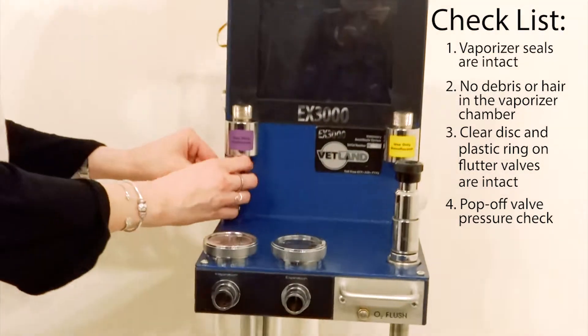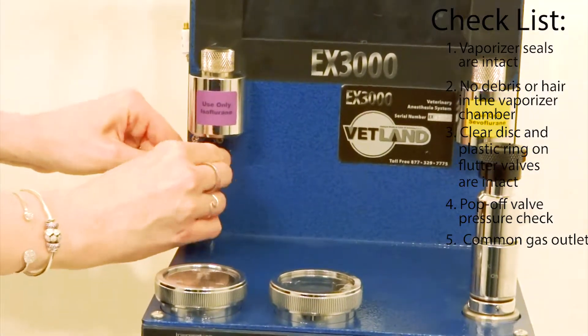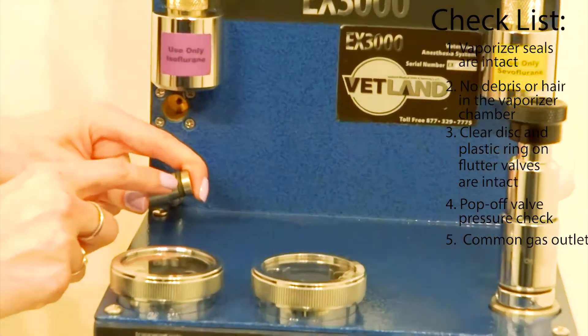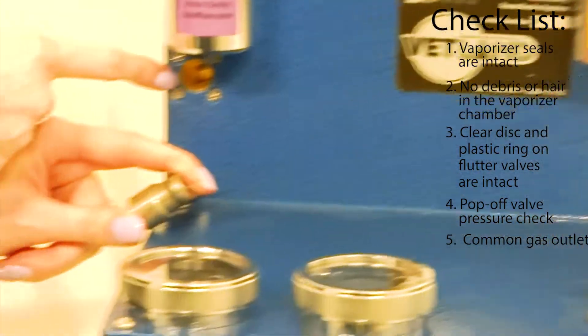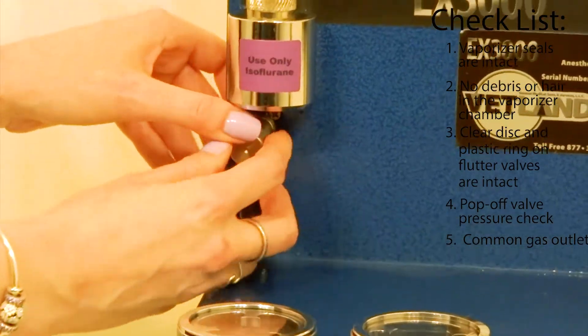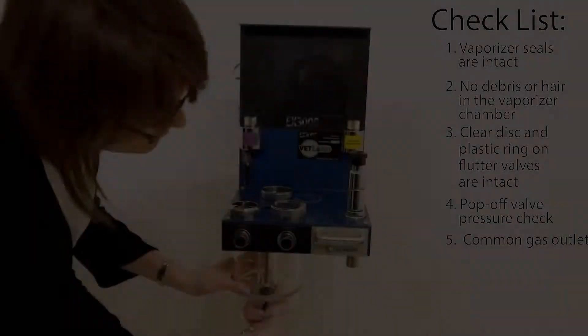Another common area for leaks would be the common gas outlet here, where you disconnect to place the non-rebreathing circuit on. There's a small o-ring here, and attaching and detaching it can cause wear and tear. Disconnect it, check the ring, and make sure you reinsert it firmly before you use it again.